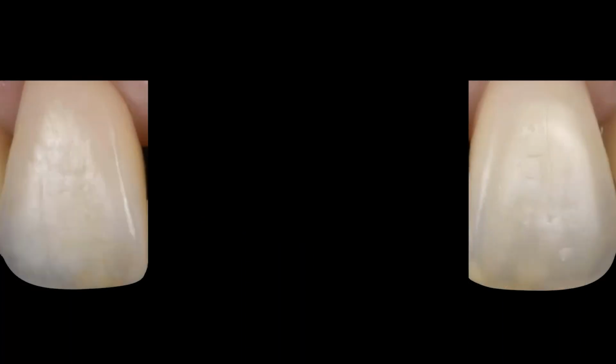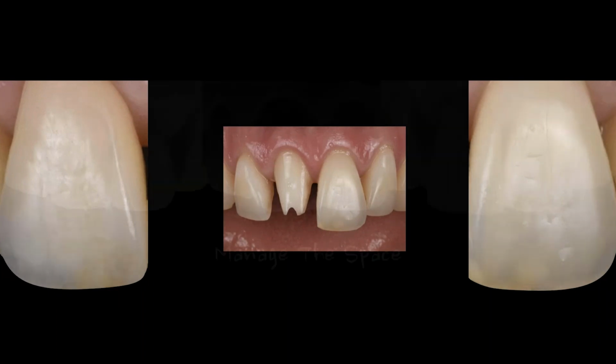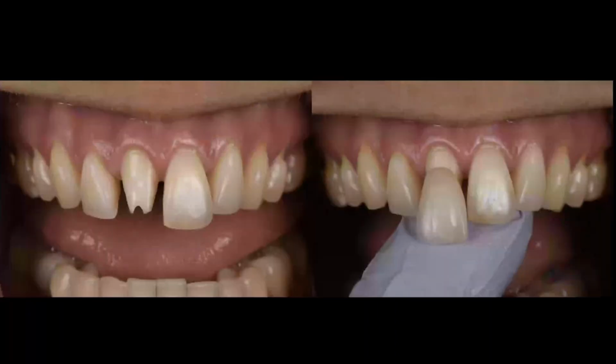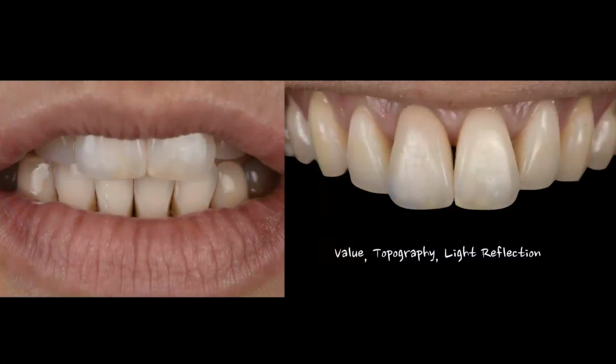And I've showed this case so many times, another single central case that was a little challenging. I'll show it today from a little different perspective. I've showed this case as a micro buildup over the last few years. This was, I think, one of the first Lumax cases, if I'm not mistaken, or the second or third, but somewhere in the early stages. What was interesting about it was obviously very little space to work in, so it was a micro layer. I only used 3 or 4 powders, and again, I showed this, so I'm not going to go into those details. But what matters for me at the end is the light and the surface topography and how they work together.